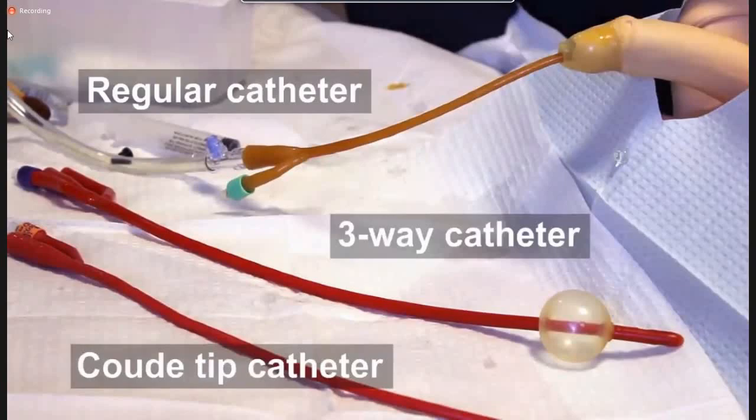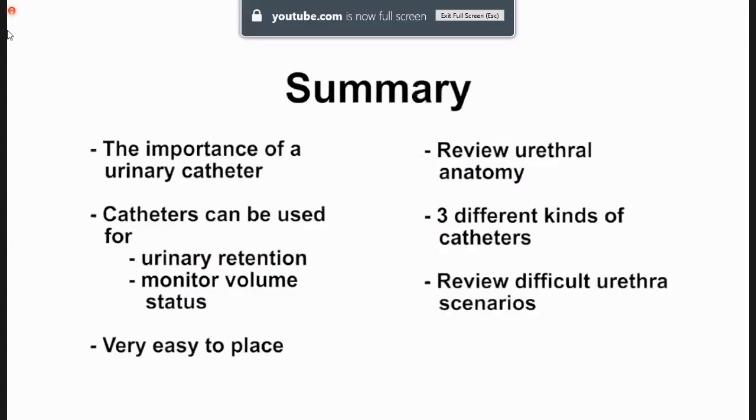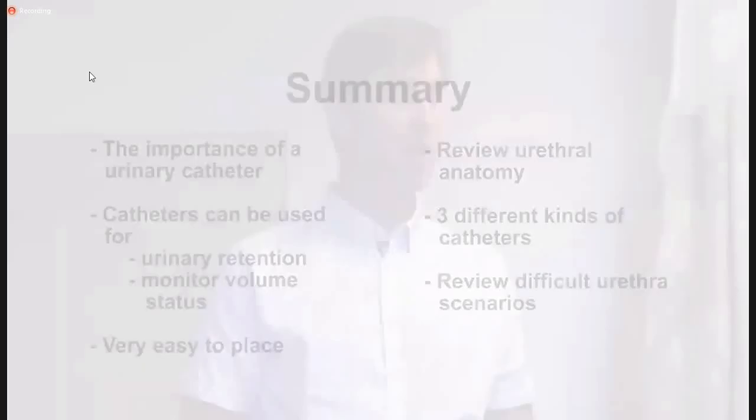And keep in mind some of the common difficult catheter scenarios that we reviewed. And whenever there's a doubt, do not hesitate to call a urologist. It's our job.